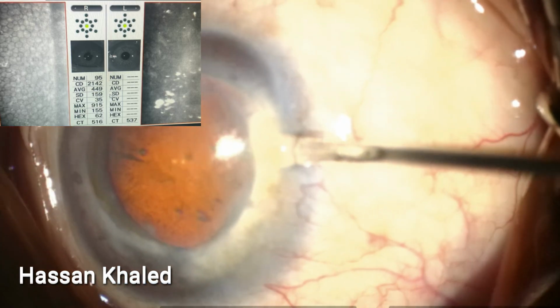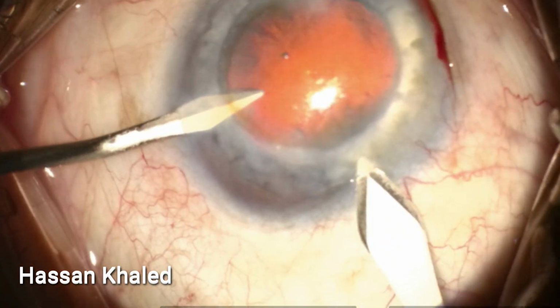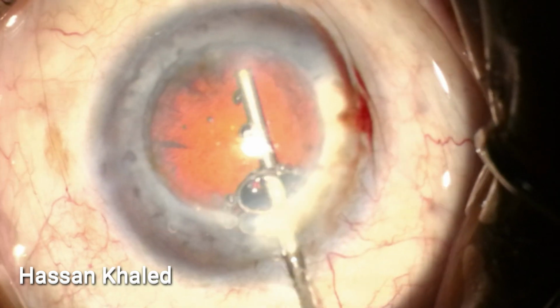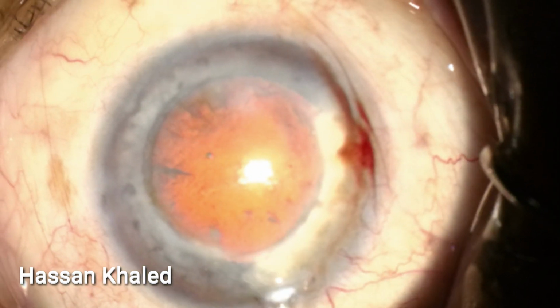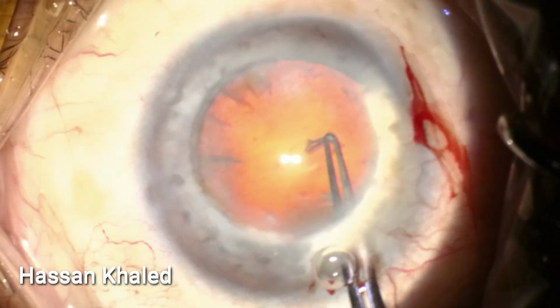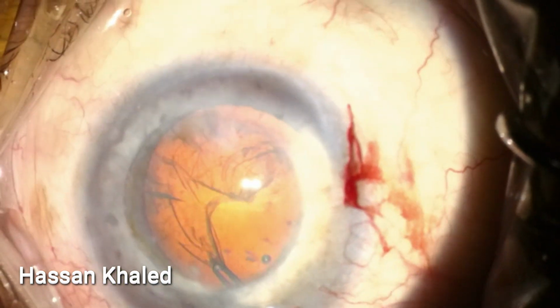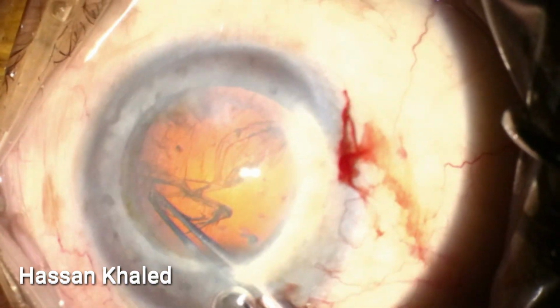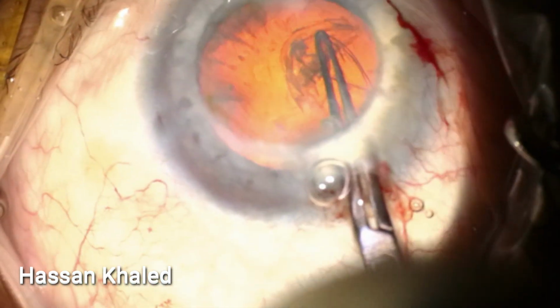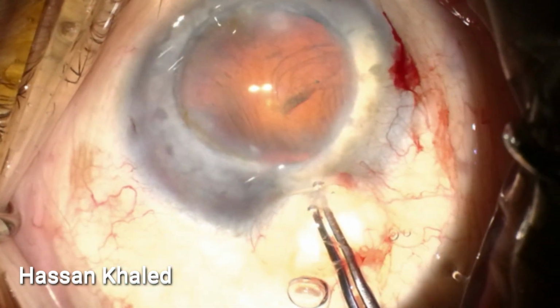Corneal endothelial cell count wasn't detectable in my case because of corneal scarring and a hazy cornea. I started with 2 paracenteses and a 2.4 clear corneal incision away from the graft-host junction, then a backfill technique using the dispersive OVD to protect the back of the corneal graft, then started the capsulorhexis. As we can see, it's about 5.5 millimeters, well centered, well sized.